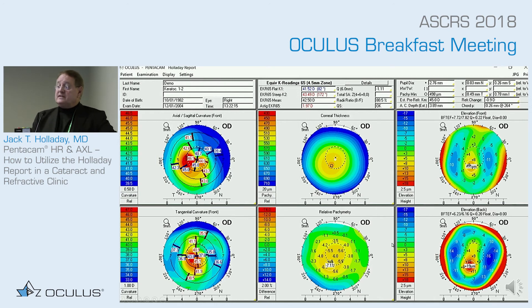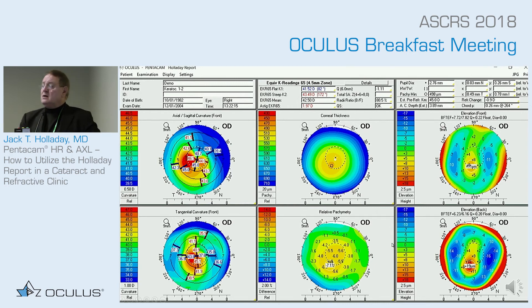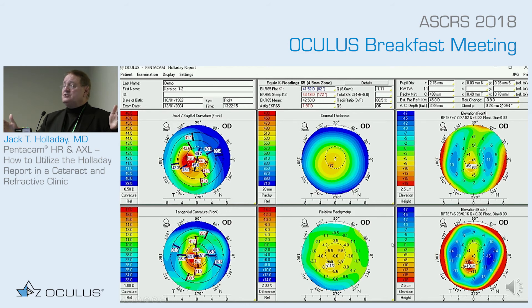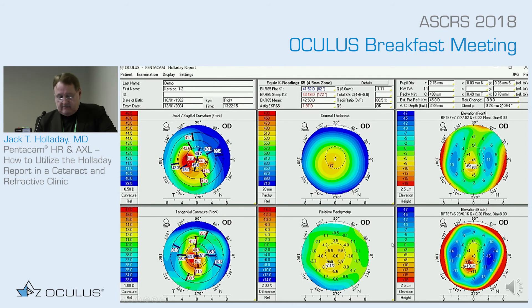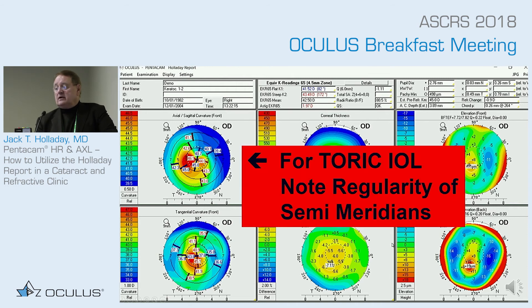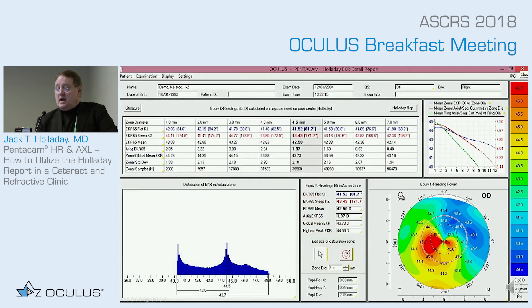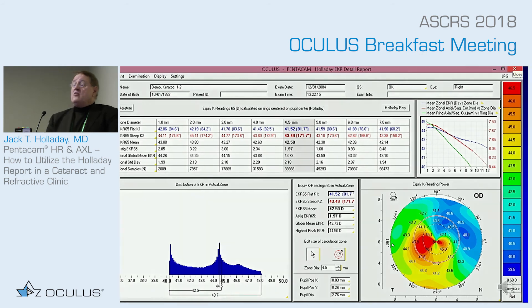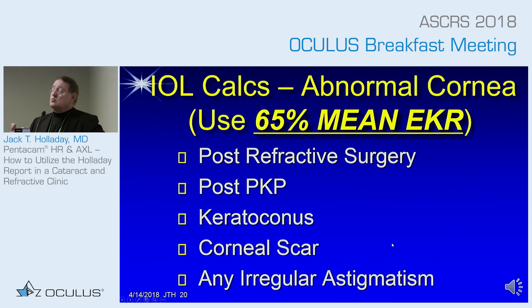Looking at another patient: in the upper left, look at the breaks in those meridian lines — that patient is not going to have good vision with a toric IOL because there is no axis that accurately represents their astigmatism. They have an asymmetric bow tie with irregularity. So even though we can give you the best K readings, you can predict right there that good vision is unlikely. Always look at the regularity of the semi-meridians if you're considering a toric IOL. In a keratoconus case, you see a bifocal cornea — high power for near, lower power for distance.